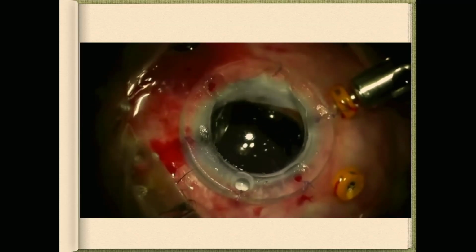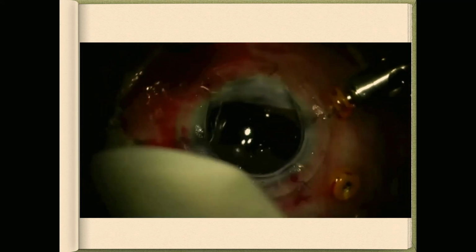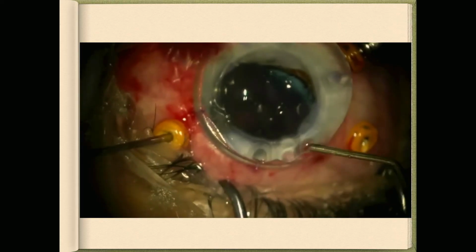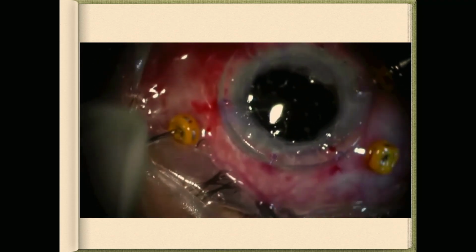At the first of the surgery, I tried to work through this corneal window, but it wasn't helpful. So I shifted to the temporary keratoprosthesis, using the suction trephine, as we see here, and removing this button. We should take care to put in the infusion before doing anything, to get a safe intraocular pressure while working. This is the case after I entered. As we see here, there is much fibrosis. Sometimes we can put viscoelastic material at this part so you can see better. We don't put saline, of course, in these cases, but putting viscoelastic material makes the visualization more helpful.